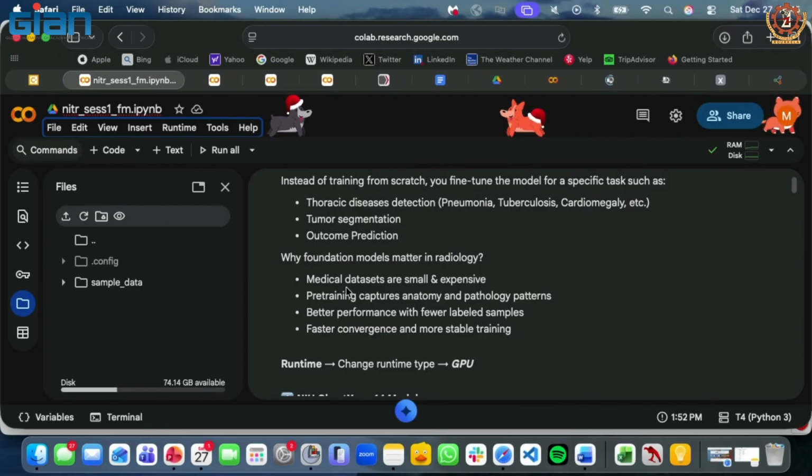But will you find millions of brain cancer MRI scans? Absolutely not. So in the case of medical imaging, training a foundation model becomes important. You might have 20,000 MRI scans, let's say 70,000 chest X-rays and 100,000 CT scans. Combined, this becomes a big enough data set to train a model, which is not possible individually.